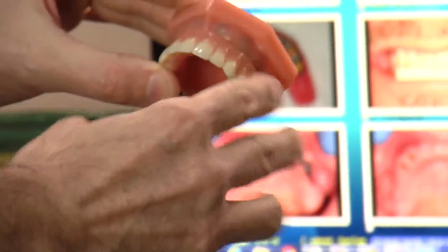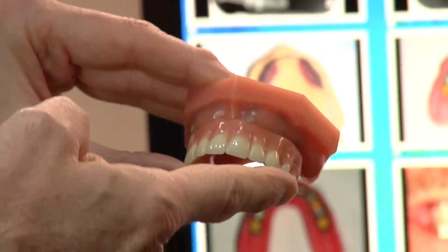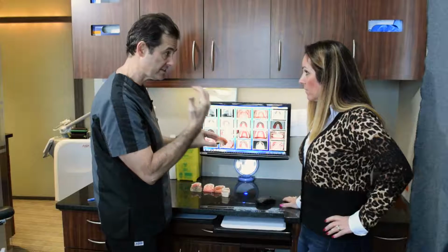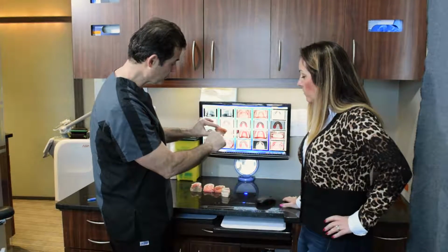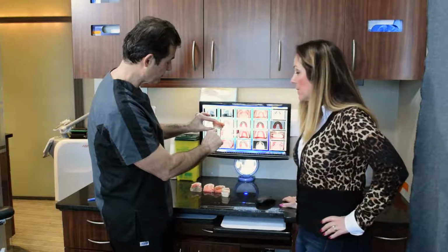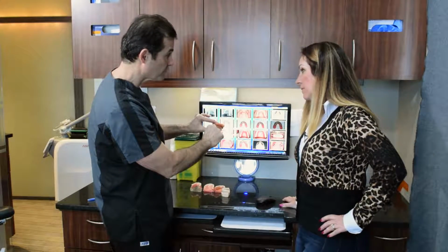Okay. So this would be something for somebody who has had a lot of bone loss, right? When they've had a lot of bone loss, the teeth still need to be in a position where you can see them. So when you smile, you still want to see the teeth. So that's how we know where the teeth are in space. Okay. And then we have to, of course, go from the position of where the teeth are all the way up to where the gums are.